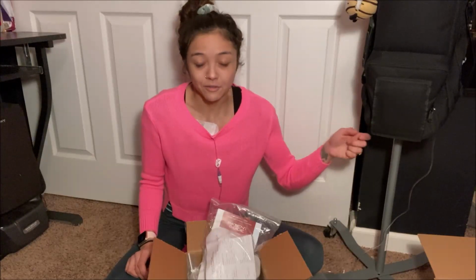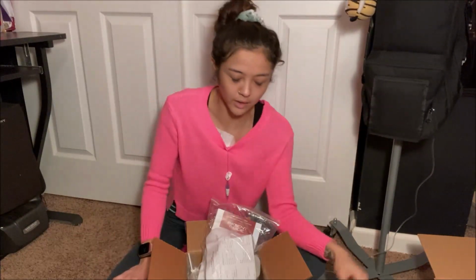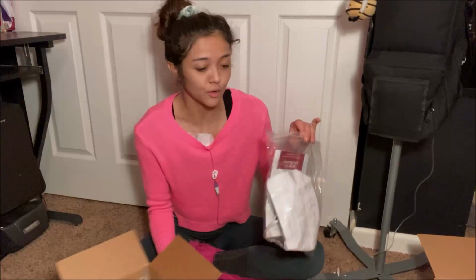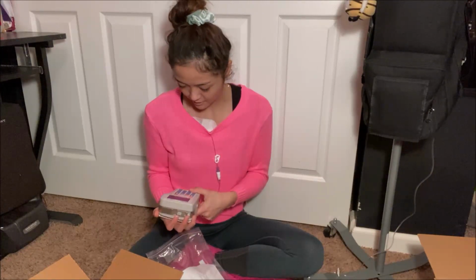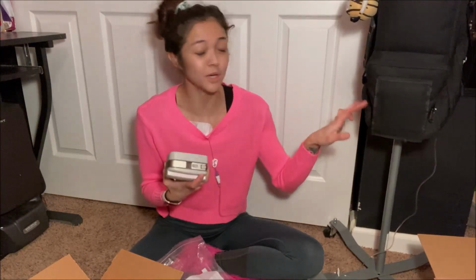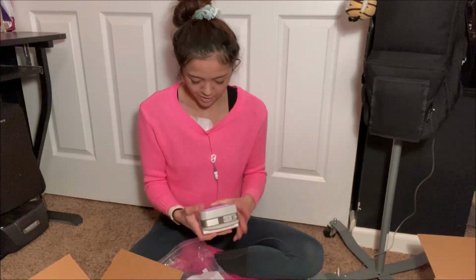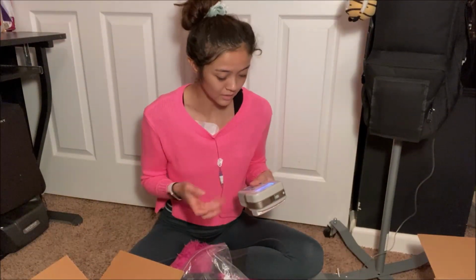But anyways, I had to take out the batteries, and it kept showing a checkered board screen on here. I had to take out the batteries and put new ones in and then press off. I don't know why, but that's what I had to do to make it stop. I never reported this to my pharmacy, so I don't know if it just needs updating or what, but this one looks exactly the same. That's the checkerboard screen I kept getting on this pump. I'm not sure why they sent me a new one. It's kind of weird.